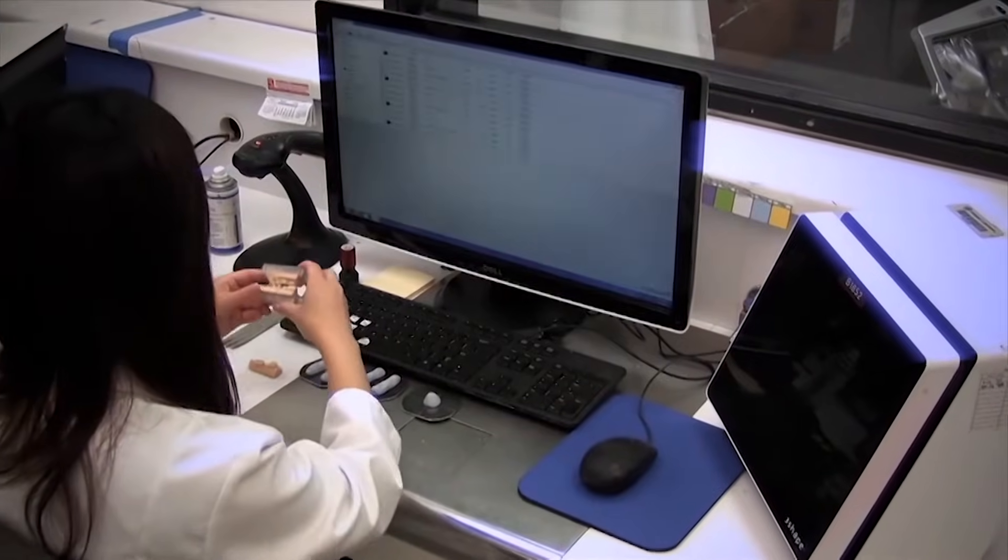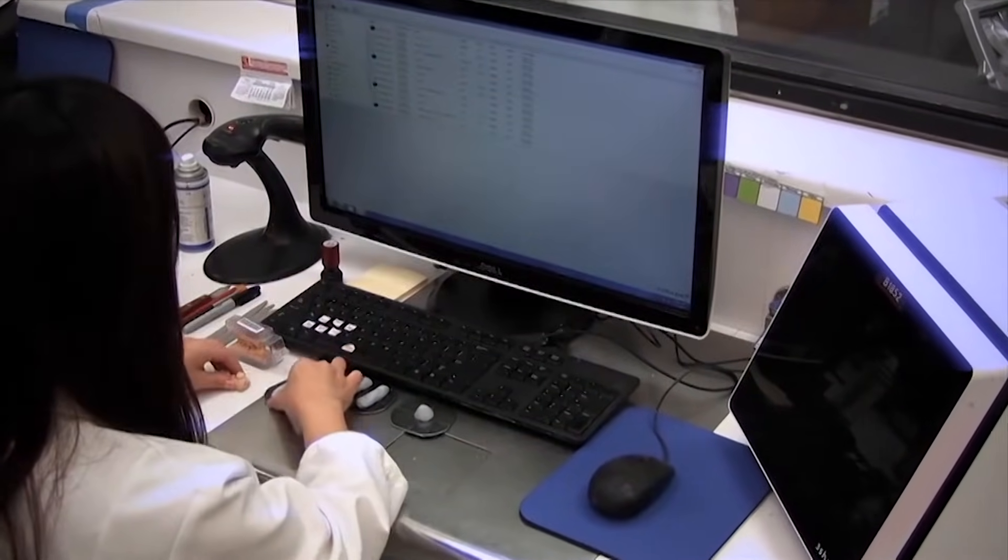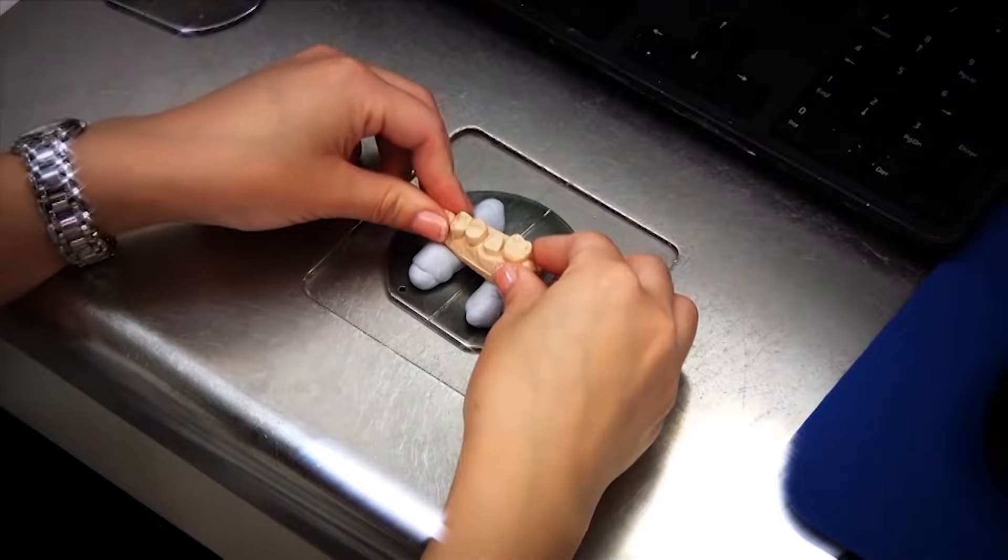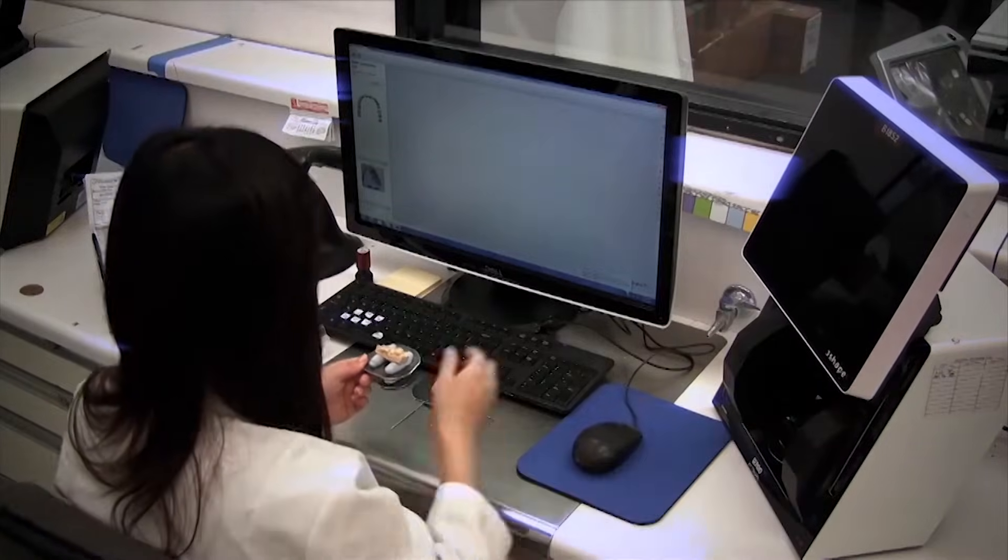So here's the production of a Bruxer crown start to finish. This is a dentist who sent us a polyvinyl siloxane impression, so we poured it up in stone. There's the stone model right there of the prep arch.